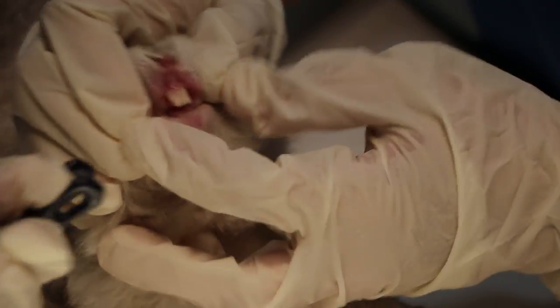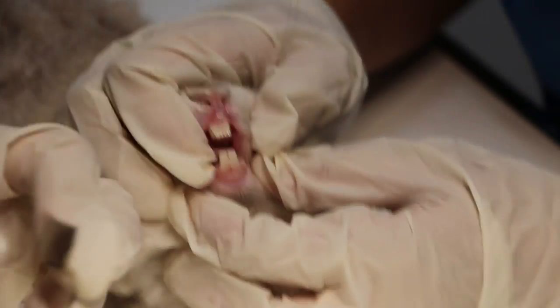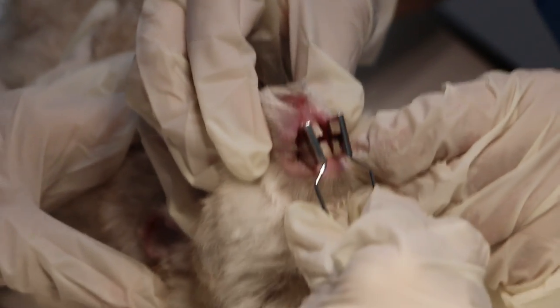First we take away the instrument set. We will demonstrate on this rabbit. First of all the mouth gag, and how it's being used. Go to the side — cheek dilator first. The cheek dilator opens the cheek sideways.